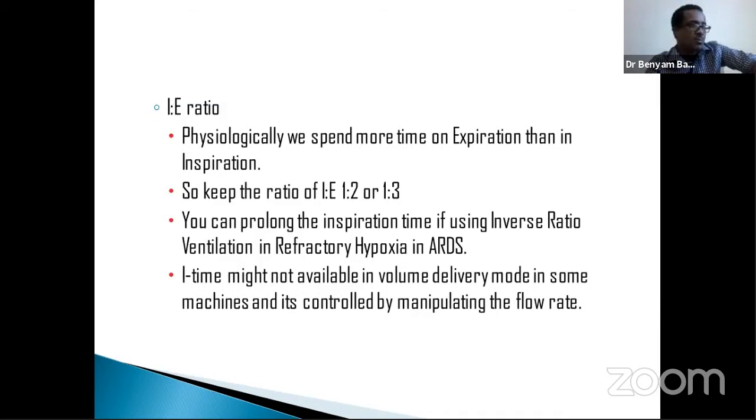So in this case, we play with the oxygenation, which I discussed earlier. How can we increase oxygenation? One, increase the mean airway pressure. How do you increase the mean airway pressure? Increase PEEP, and increase the inspiratory time. By increasing the inspiratory time, you're prolonging the mean airway pressure.